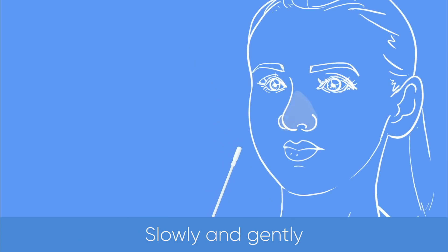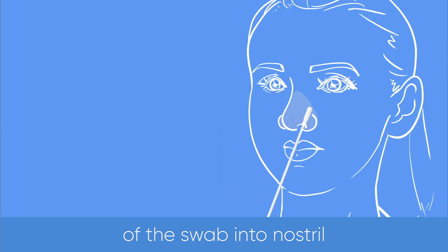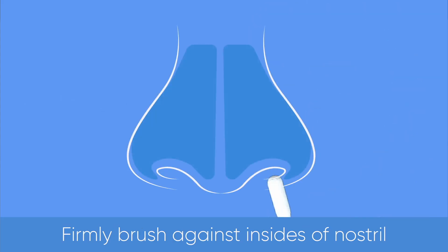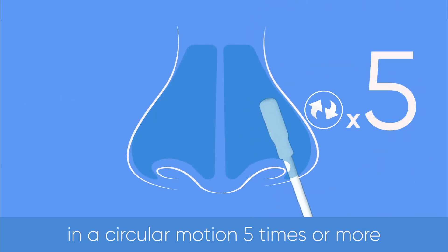Slowly and gently insert the entire absorbent tip of the swab into the nostril. Usually insert one-half to three-fourths of an inch. Firmly brush against the insides of the nostril in a circular motion five times or more.